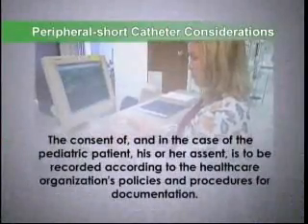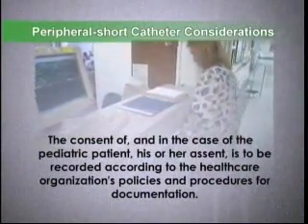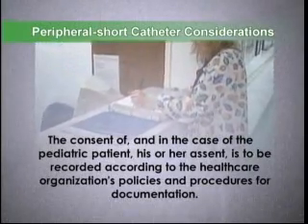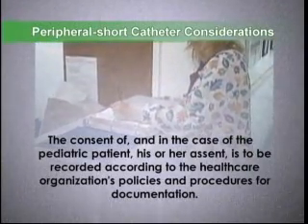During the process of acquiring vascular access, the nurse must remember to obtain the patient's consent for the procedure, in addition to acknowledgement and agreement to participate in the prescribed infusion therapy. The consent of, and in the case of pediatric patients, his or her assent, is to be recorded according to the healthcare organization's policies and procedures for documentation. This critical information is to be placed in the patient's permanent medical record.